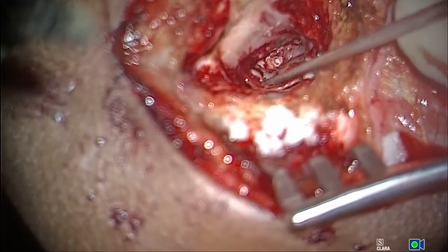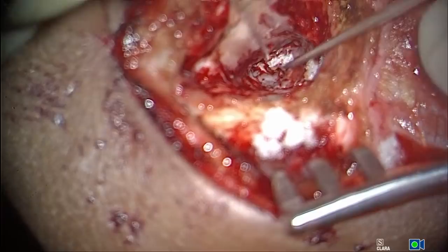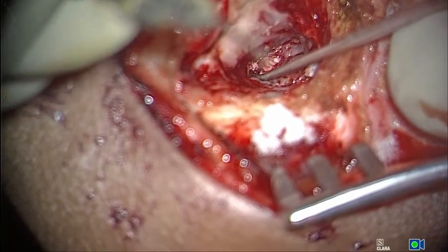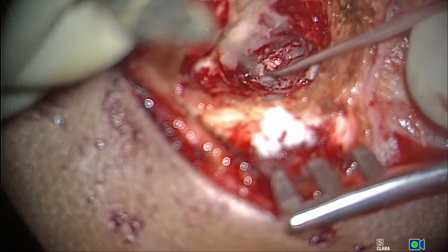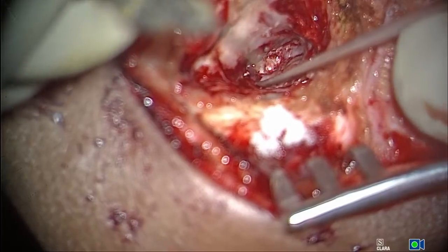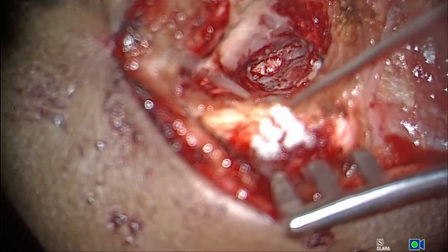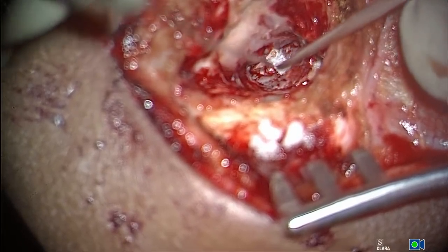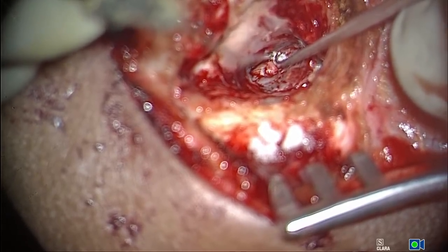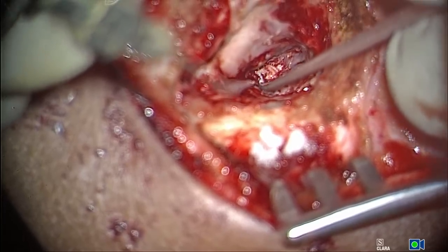So you can see that now very clearly. Now what I'll do is keep a gel foam here and nicely press against that gel foam. See how nicely the perforation is closed. Can you all appreciate that? Never fails. There is no doubt, because you kept it underneath the malleus and all around the perforation. And you see how I'm handling that gel foam also. You're not putting suction directly.